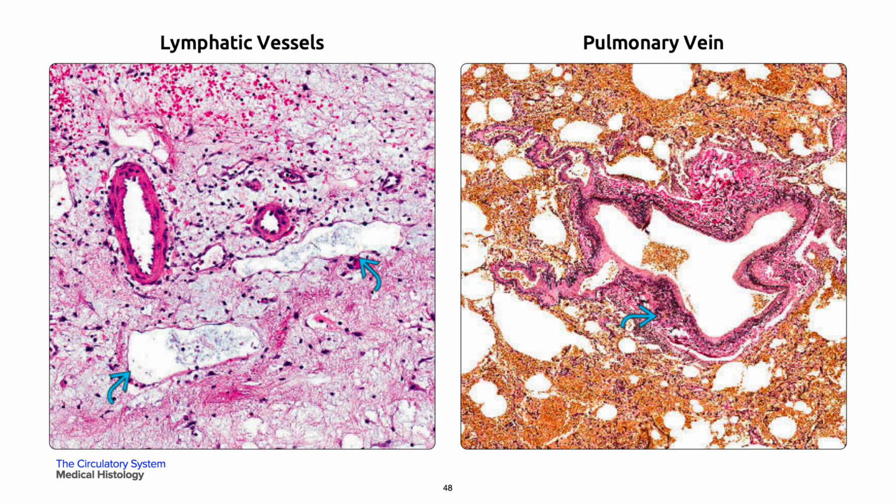On your left is two dilated lymphatic vessels in a curved blue arrow that are seen within the organizing granulation tissue. Lymphatics are composed of a single layer of endothelial cells with minimal supporting connective tissue. There is little to no muscular medial wall, and they often have irregular luminal contours.